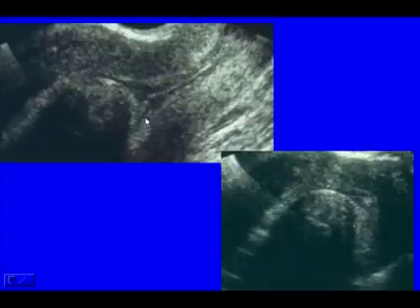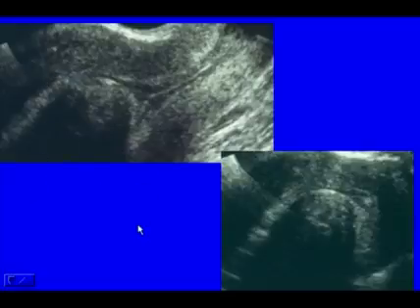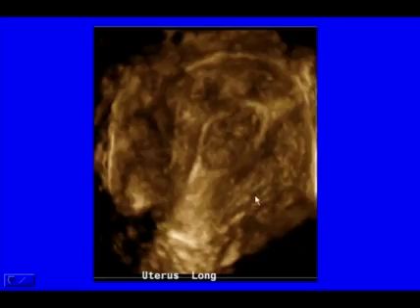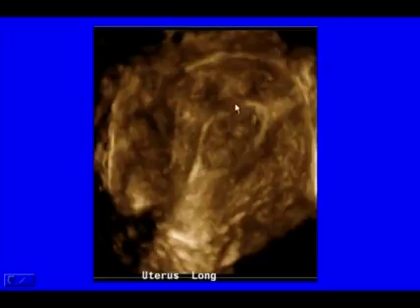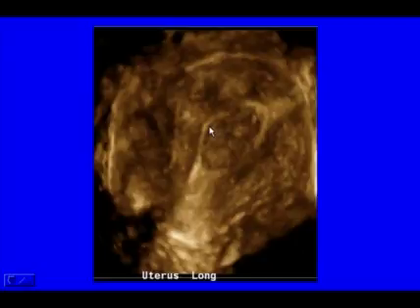On transvaginal view in sagittal projection, we see the endometrial cavity with the endometrial mucosa being displaced by a heterogeneous mass with posterior acoustic shadowing. On the transverse view, we see nicely the hypoechoic heterogeneous mass with shadowing displacing the endometrial cavity. A 3D acquisition coronal image shows an intracavitary fibroid with the endometrial cavity surrounding it. This 2D coronal view obtained from 3D acquisition is very helpful in identifying the location of submucosal or intracavitary fibroids.